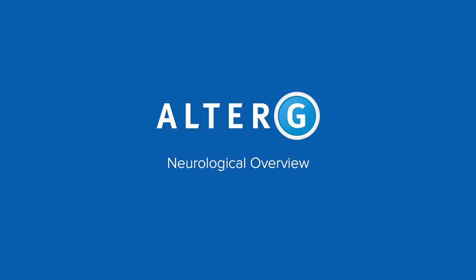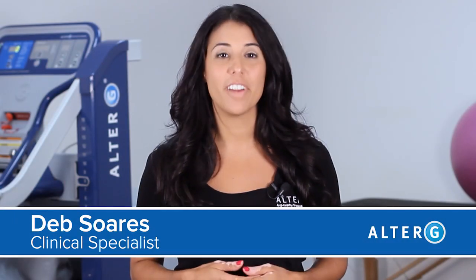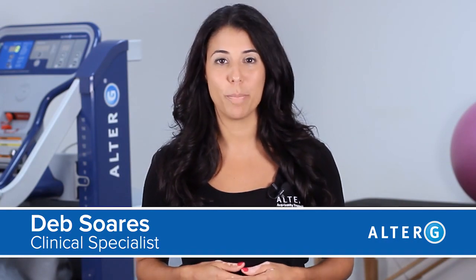Hi, I'm Deb Soros, Clinical Specialist at AlterG. We're going to review the foundations of using the AlterG with your neuro patients.